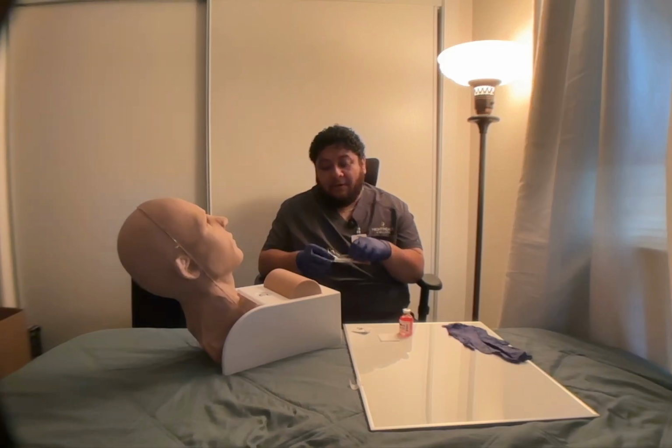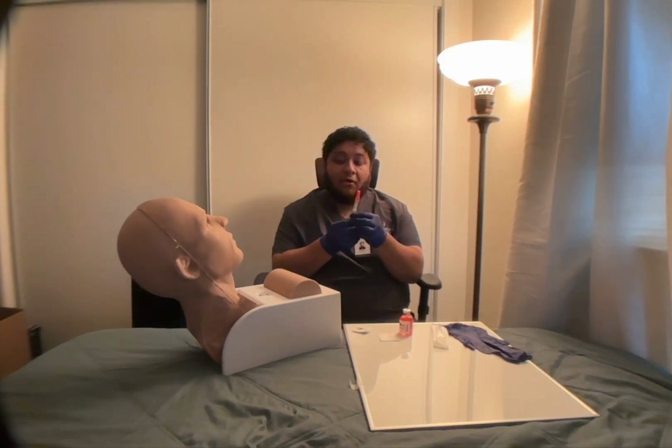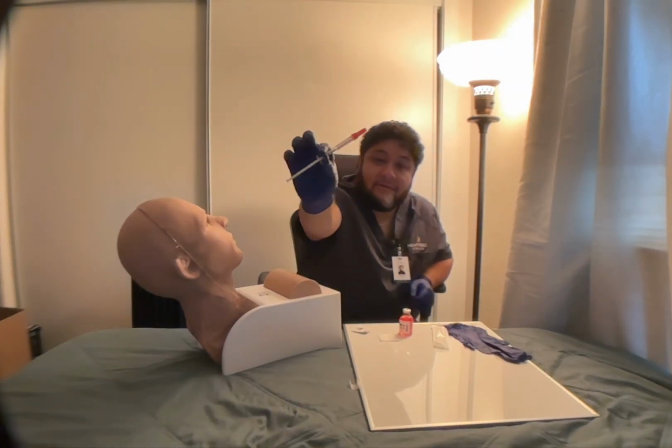Okay, so I will remove it from the packaging, and I'm going to draw 1 milliliter of air. Like so. Just to verify, here's the syringe, 1 milliliter.